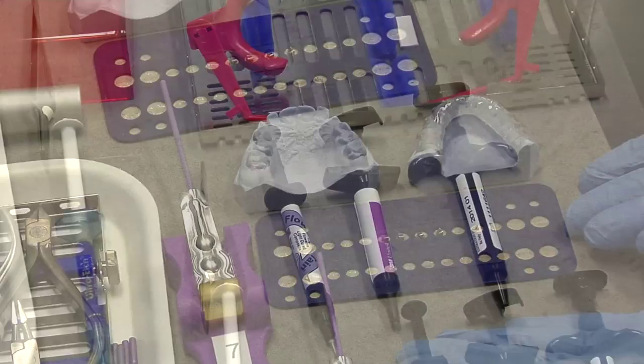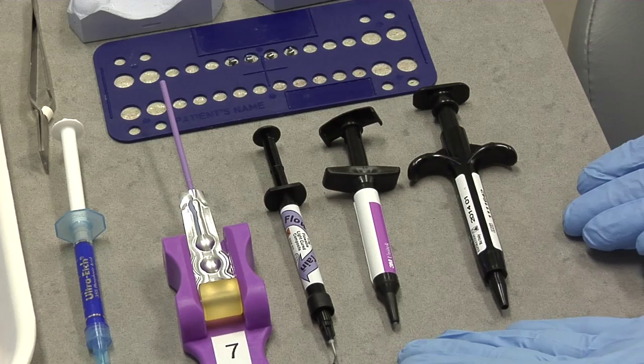Also, we have something called a curing light. And what this does is it hardens the glue. It's an ultraviolet light.